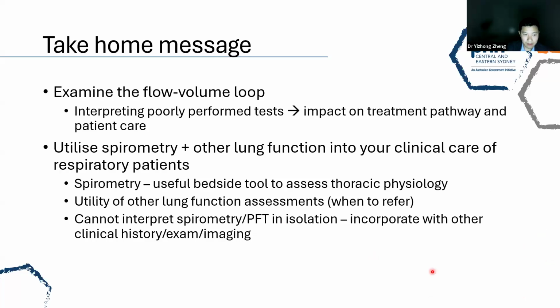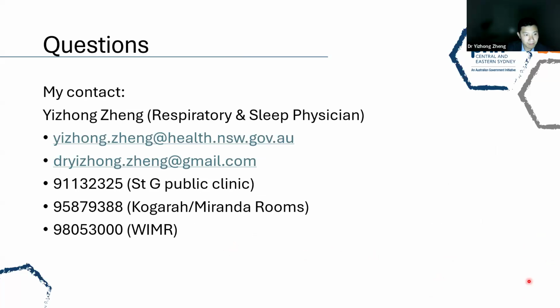And then, you cannot interpret spirometry and lung function tests in isolation. Incorporate with clinical history, exam, and imaging. Any questions, feel free to email me or direct it to me, but I'll see any in the chat.